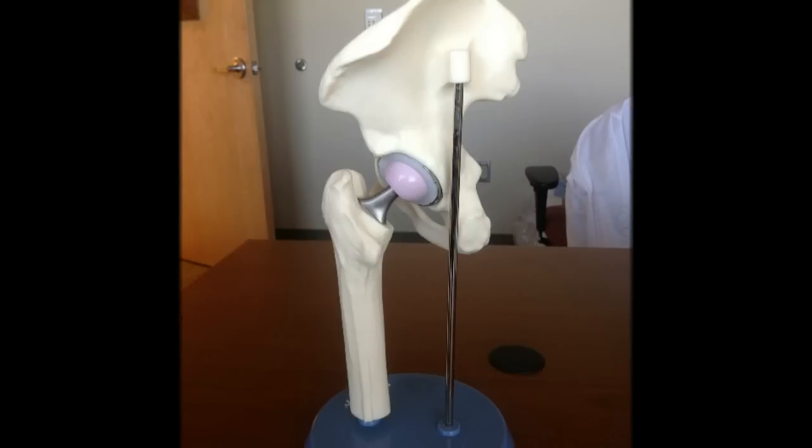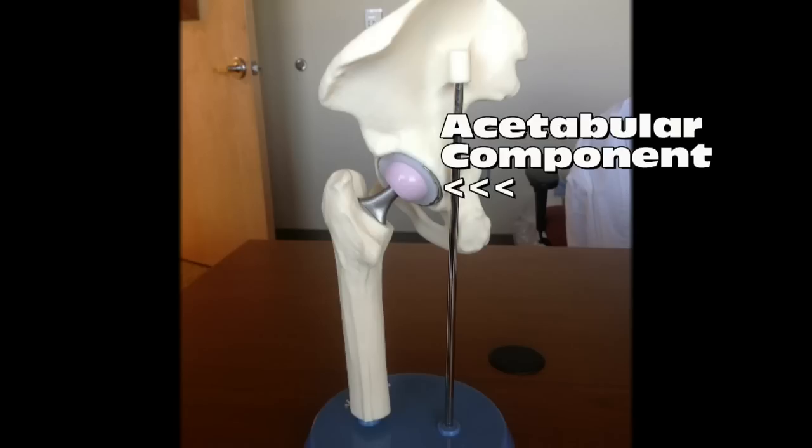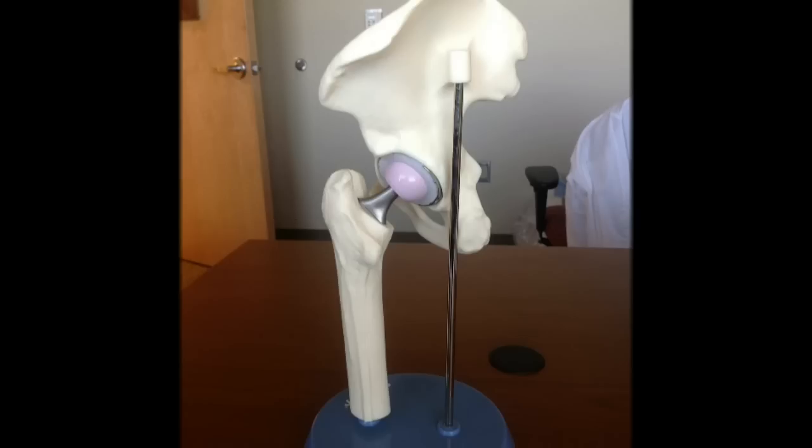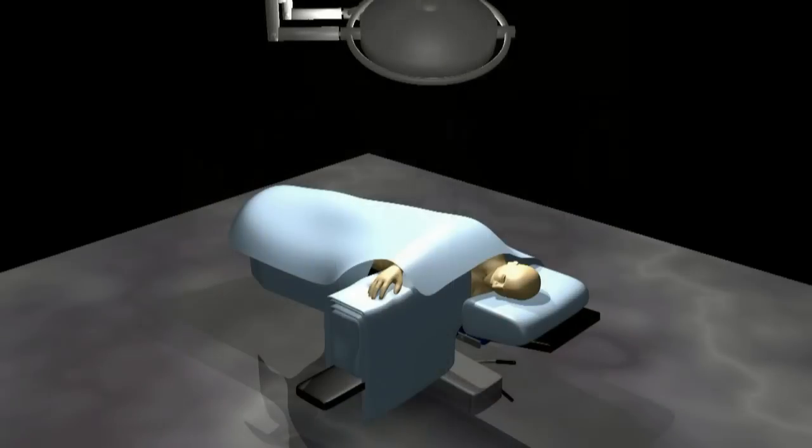Hip replacement surgery involves replacing the worn out joint surfaces with metal implants. Usually the implants include an acetabular component (the hip socket), a femoral component, and a plastic liner. The patient is positioned on the operating room table.